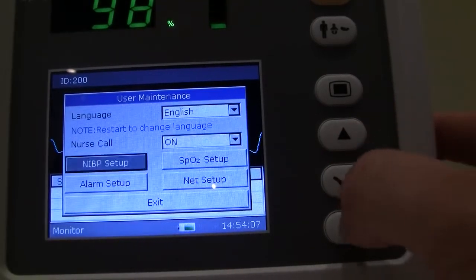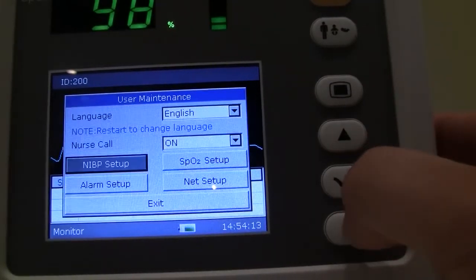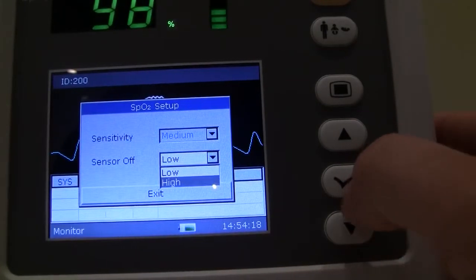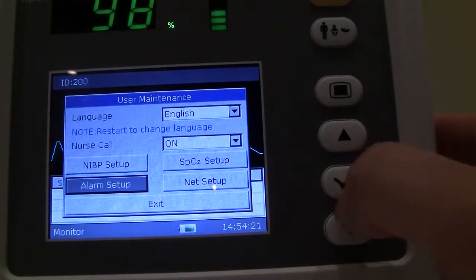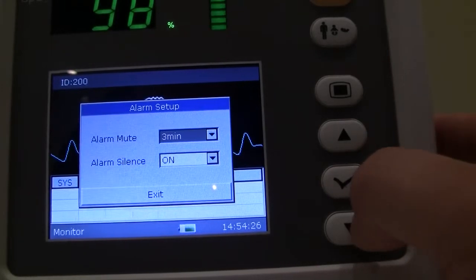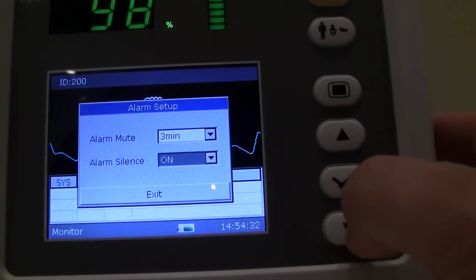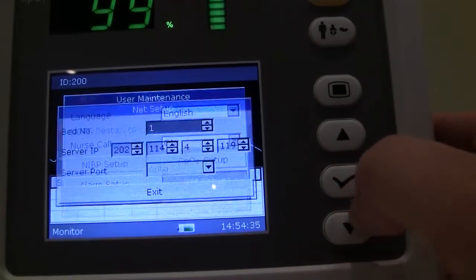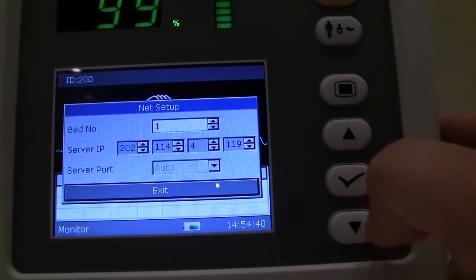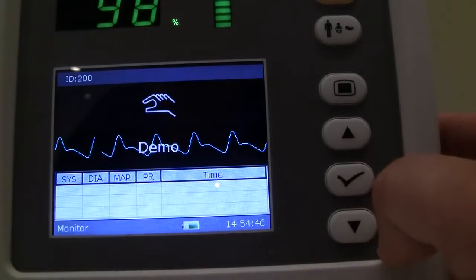Nurse call you can turn on and off. NIBP setup to capture data or not. SpO2 setup, you can change the sensitivity of the sensor from low to high. Also in that screen, sensitivity. Alarm setup, you can do your alarm mute every 1, 2, or 3 minutes, whatever you so choose. And right now we have the alarm silence on, just for demo purposes. And here's where you would go to actually network this unit if you were going to hardwire it to a computer to transfer data. Pretty easy user interface, pretty self-explanatory.